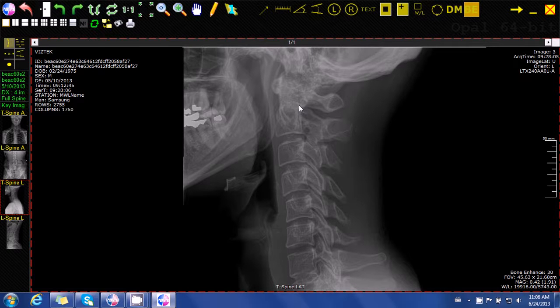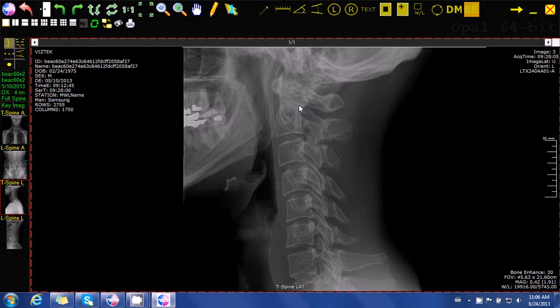The George's Line tool can be used to determine the amount of anteriority or posteriority that a vertebra has in relation to the segment below it. To use the George's Line tool, simply click the top and the bottom of the posterior vertebral body of each segment from C2 through C7.